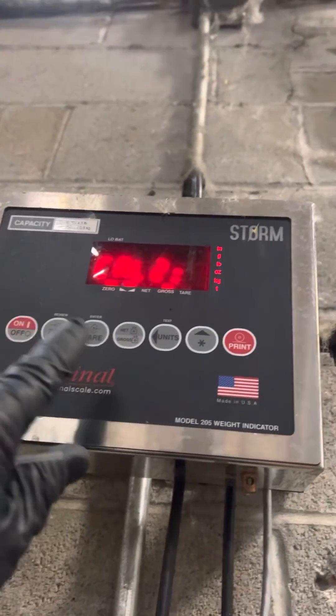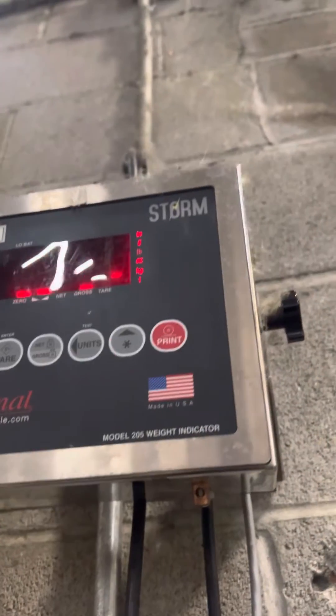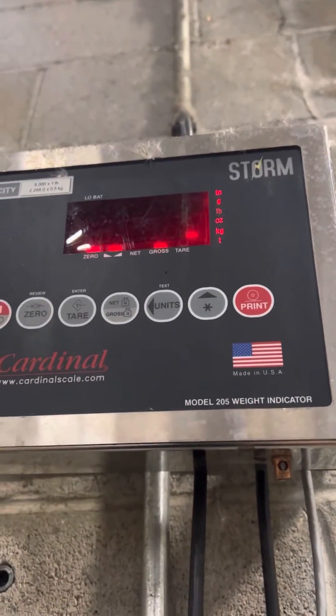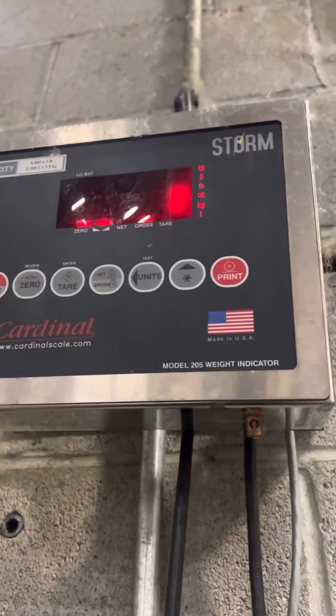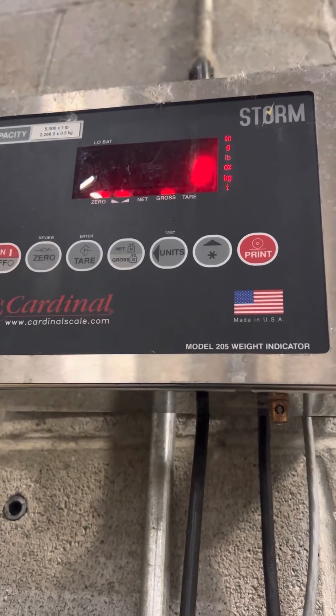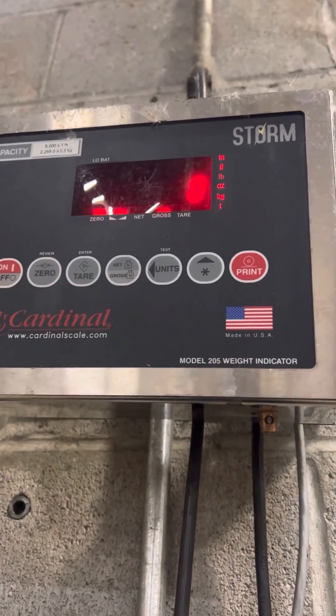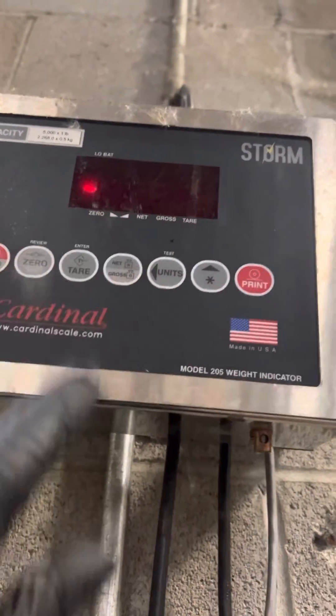Now you're going to press ENSER. It's going to ask for a zero — you're going to take the weight off. And then you're going to press ENSER.